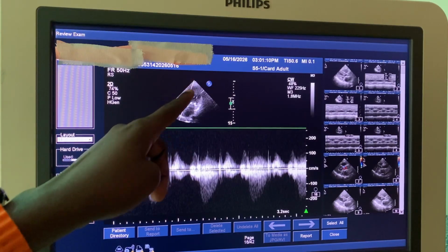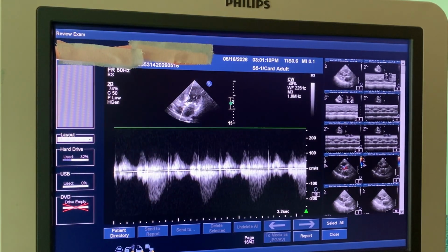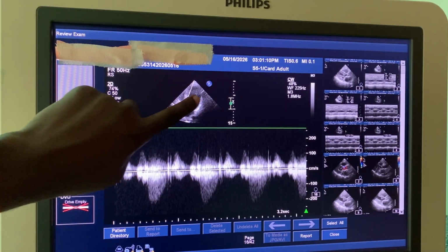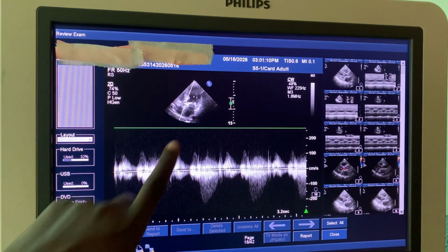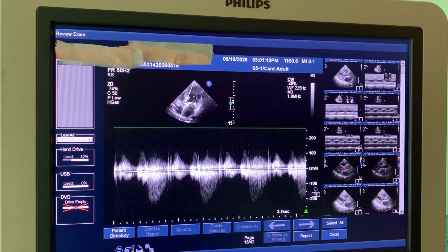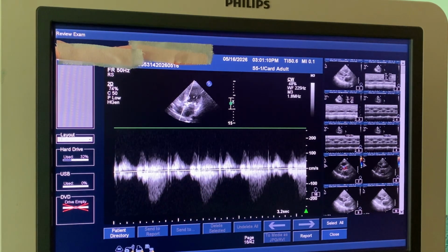If I put my Doppler scan line here, it is passing through the sigmoid septum, meaning blood flow here is blocked, and now it has to change direction going this side. Meaning this one is not parallel to the direction of blood flow. So the velocity I'm going to get here is less. It is an underestimation of the velocity because of the sigmoid septum. But we're using continuous wave, right? Yes, continuous wave. We have confirmed there is aliasing, pulse wave cannot work.